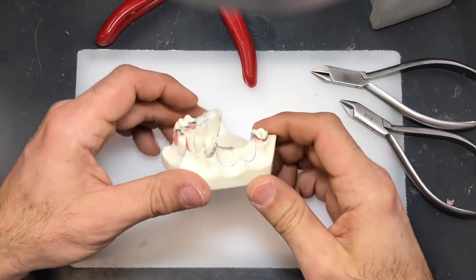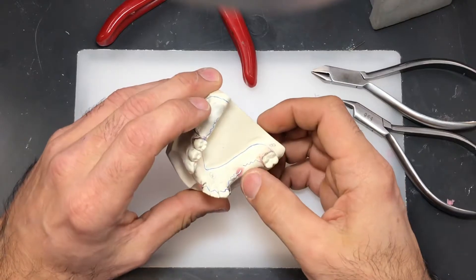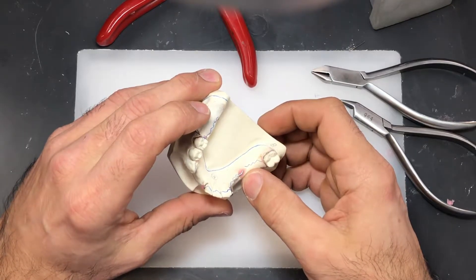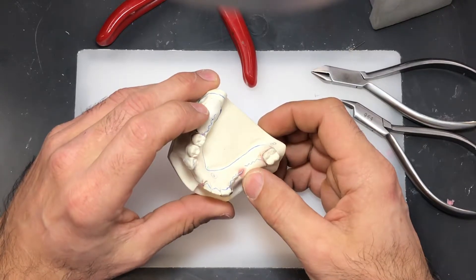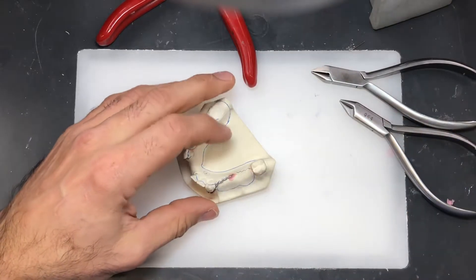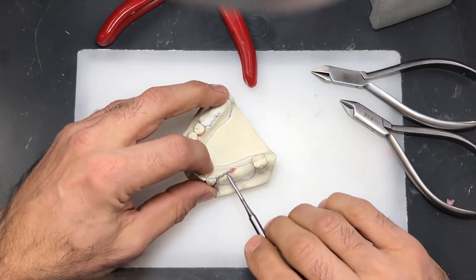Once you finalize your wire and you're happy with the fit, we're going to tag it with a little bit of wax. We're going to let that cool down and then we're going to remove our wire.